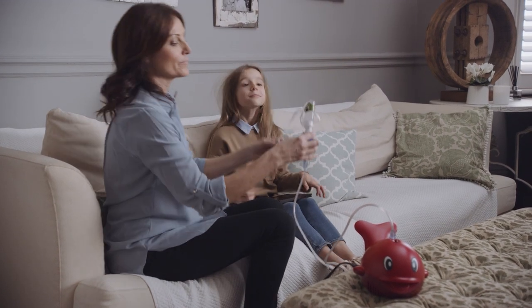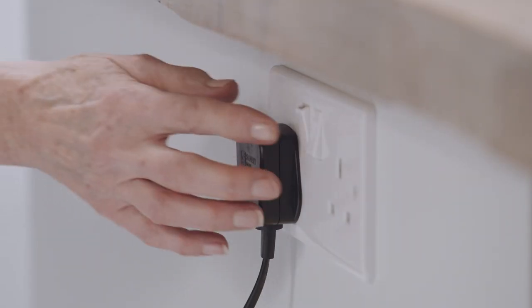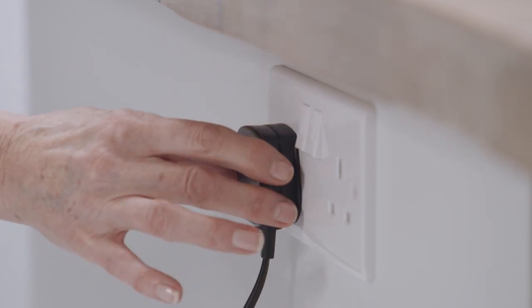There is no need to nebulise every drop of medication. There will always be a small amount left in the medicine cup. When the treatment is complete, turn the power switch off and unplug the device from the electrical outlet.